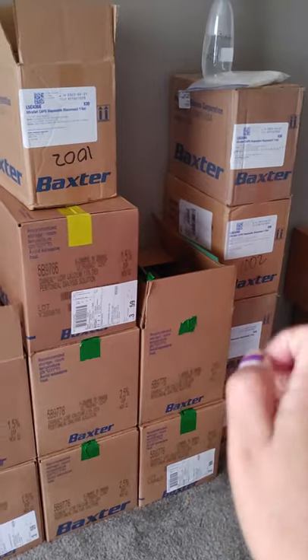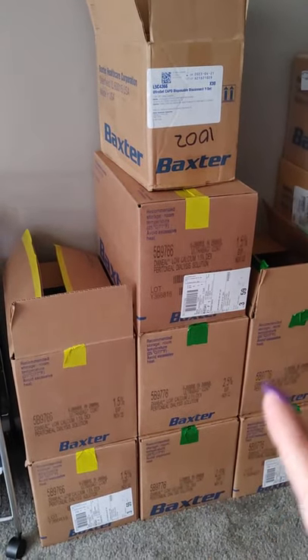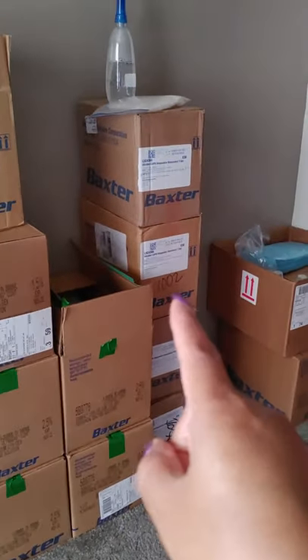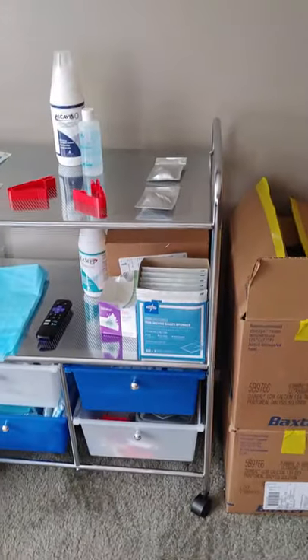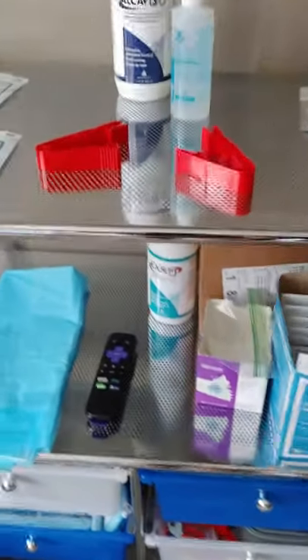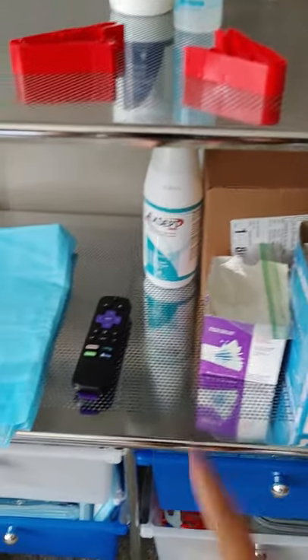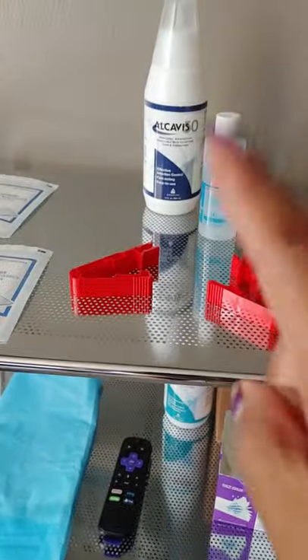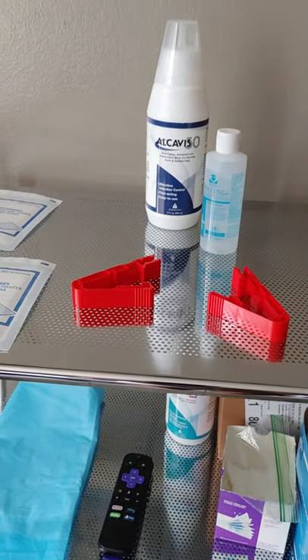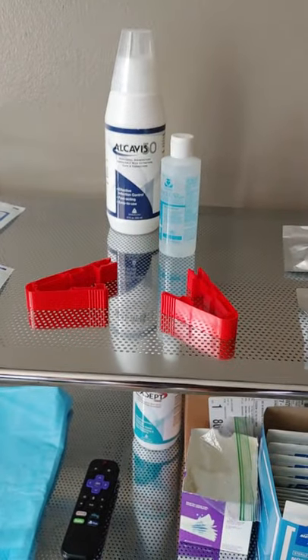Each box has six bags, and I use four a day plus two drain bags. The cart is cool because I have a box of caps back there that I can refill in case I go low. There's my ExSept for port cleaning, your Alcavis for your catheter cleaning. Always have hand sanitizer. I wish their hand sanitizer came with a pump, because a pump is better — you're just barely touching something.